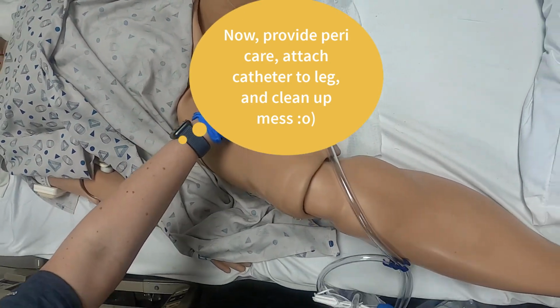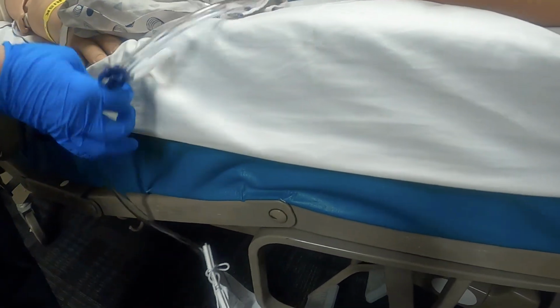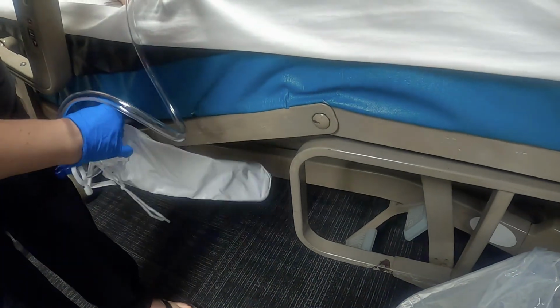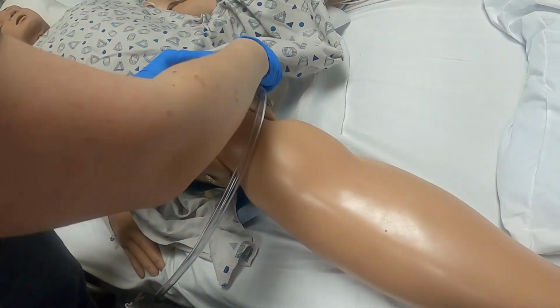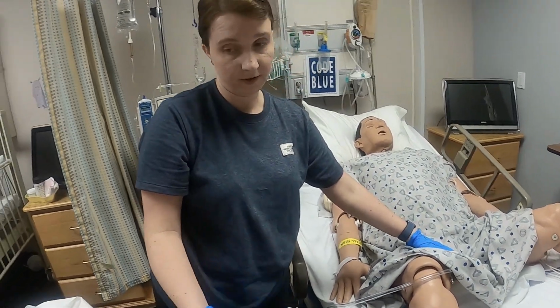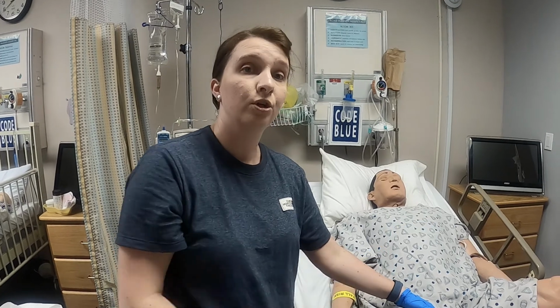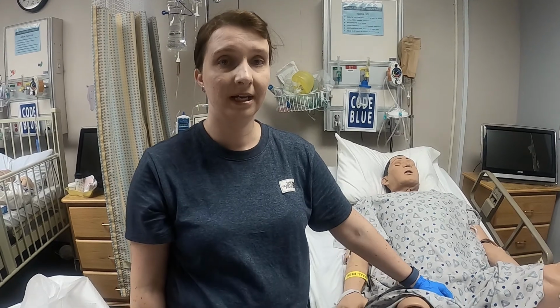His bag should hang on the side of the frame of the bed, never on any movable parts of the bed, so not on anything to the other side. So right here, for example. So we provided peri-care, right? There we go. So that's how you insert the catheter. If I wanted to remove it, I have to withdraw the 10 ml of sterile water that I inserted the catheter with, and just go ahead and withdraw the catheter as well. And that's how you insert a sterile catheter.